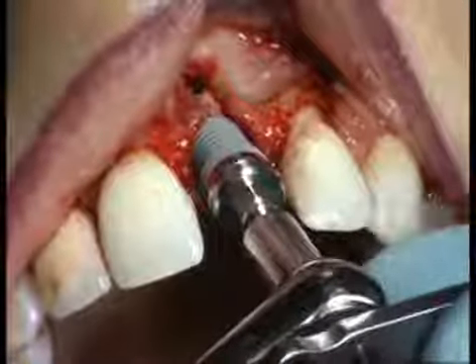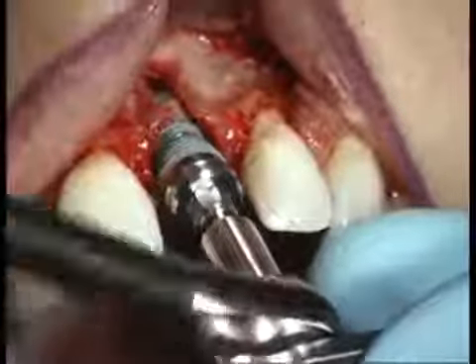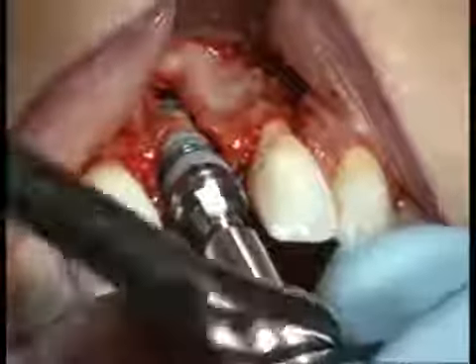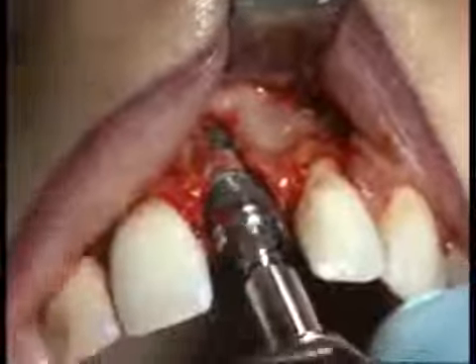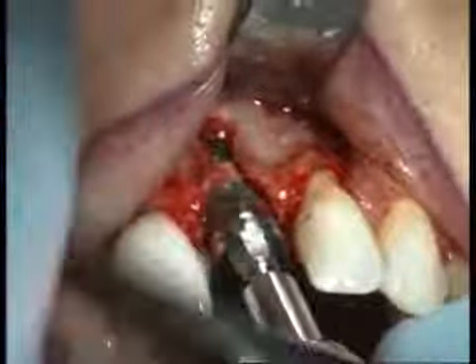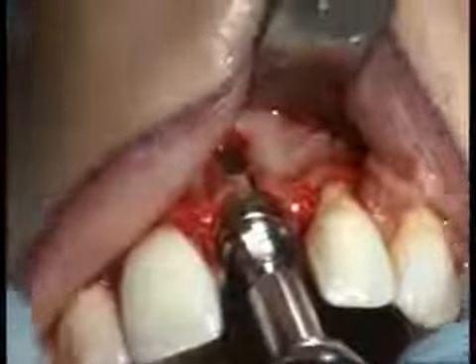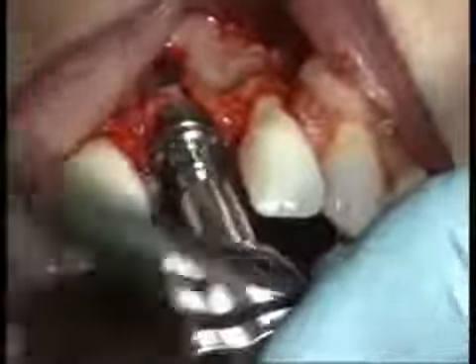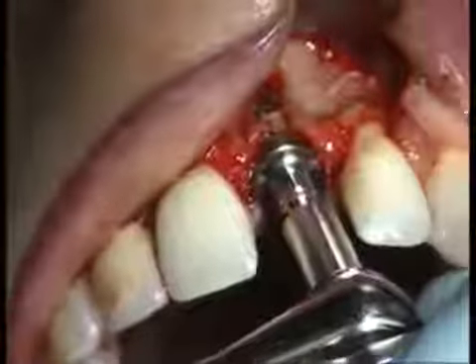The implant is inserted with the ratchet and holding key. The implant is guided through the cylindrical part and achieves adequate primary stability due to the threading in this area. The final vertical position of the implant is reached once the implant shoulder is at approximately the same level as the cemento enamel junctions of the adjacent teeth.